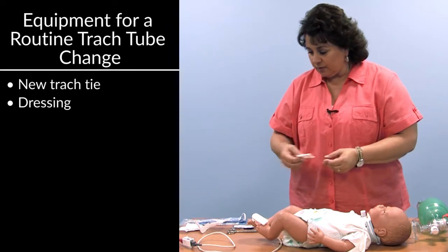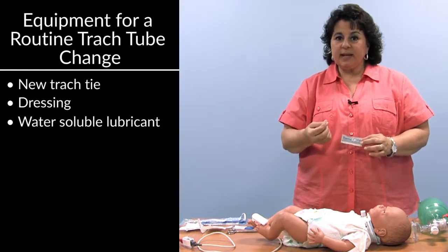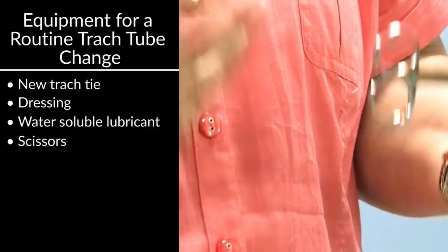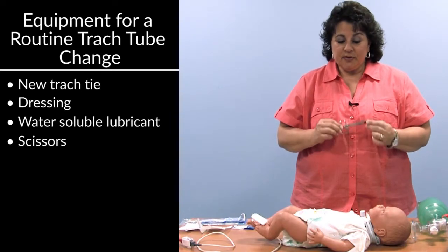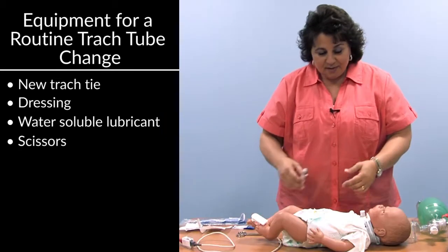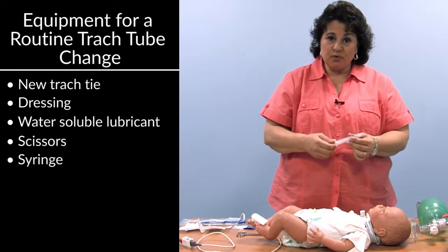Most of our families initially with a new tracheostomy tube in particular will use a dressing to help absorb moisture until the site heals. You will need some form of water-soluble lubricant that you can dip the end of the tube in to make it slide easily and pass into the stoma site after removing the tube for replacement of it. Scissors have been on the trach tube change protocols for years and years. They're still there. Today we'll be using it to help us trim down our trach tie after we've placed it in. If the tracheostomy tube has a balloon or a cuff on it and needs to be deflated to be removed, you'll need a syringe to do so.